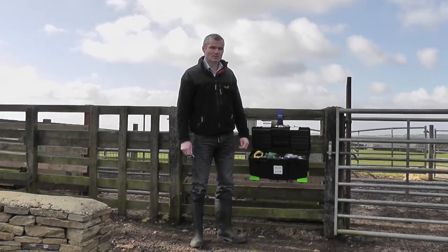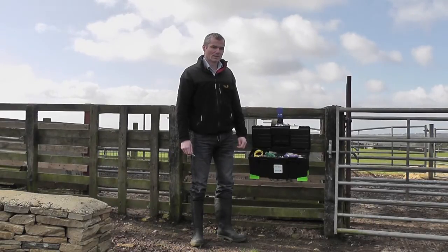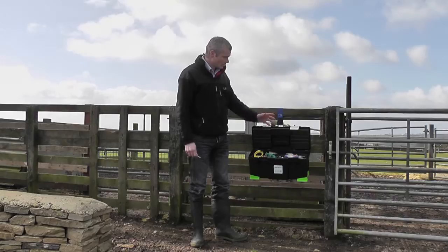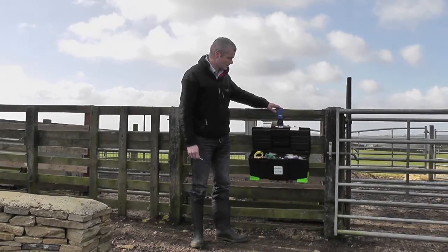Today we're at Adam Henson's Cotswold Farm Park in Gloucestershire and we're going to demonstrate the Steri-Matic systems for injecting livestock. We've got two systems, one for single dose applications and a second for multi-dose applications. All of the equipment is stored in the Steri-Matic jab box which can be conveniently attached onto the fence to keep it out of the muck.